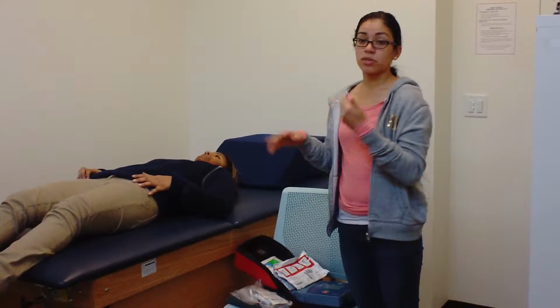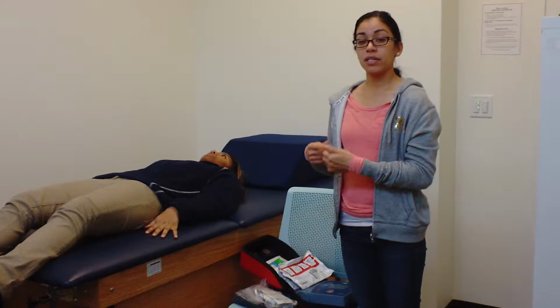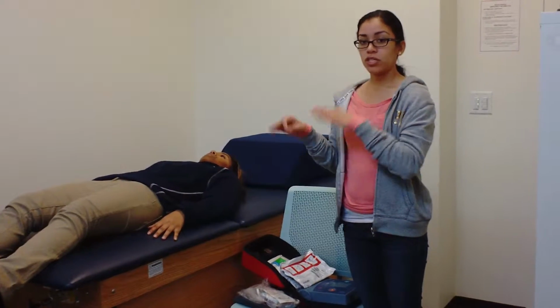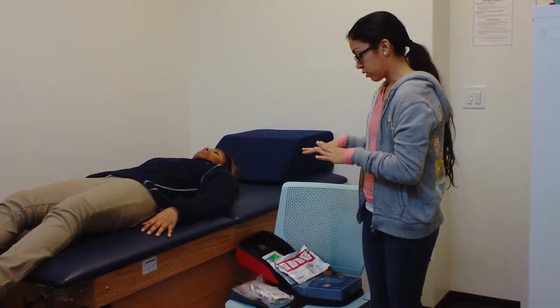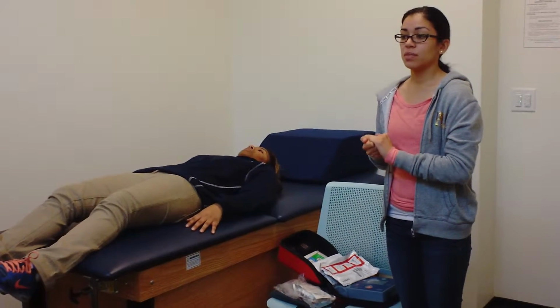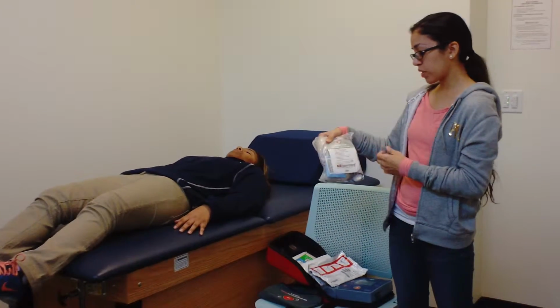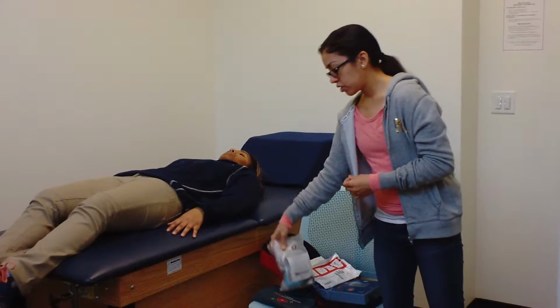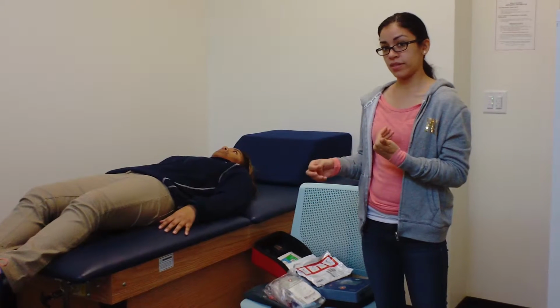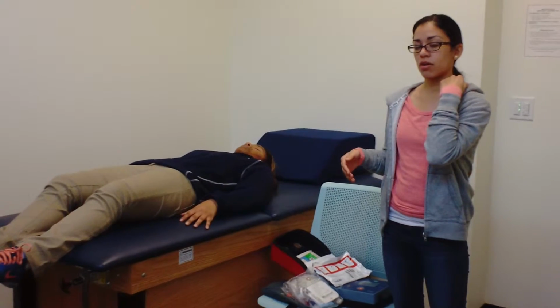What we have to do is expose the chest, whether it's a female or a male. If it's a female and they are wearing an underwire bra that is metal, I'm going to have to undo the bra so that it does not disrupt the signals that are going to be sent to the machine. If the patient is male and there's a lot of hair involved, thankfully most AEDs are equipped with a razor and a towelette to clean off the excess hair. Excess hair can also affect the signal that is going to be sent to the machine in order for it to analyze the heart rhythm.